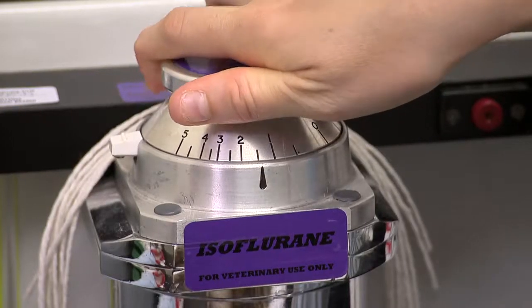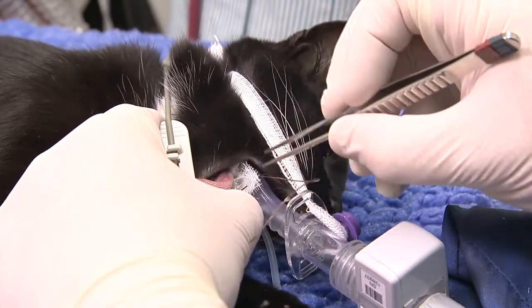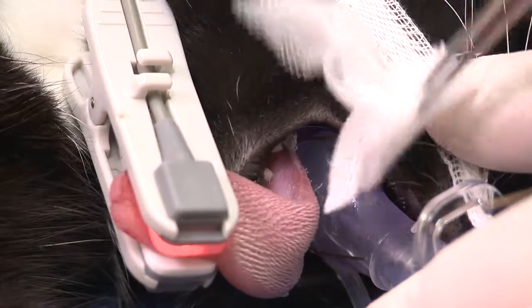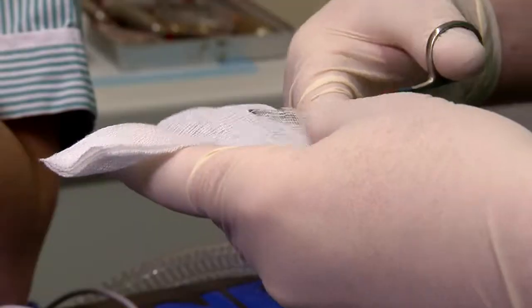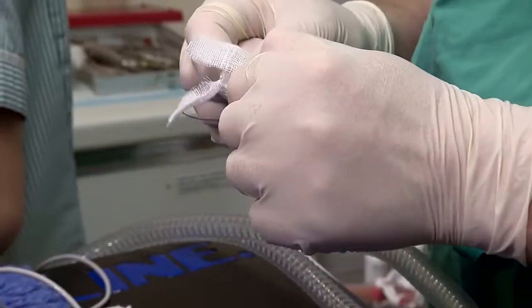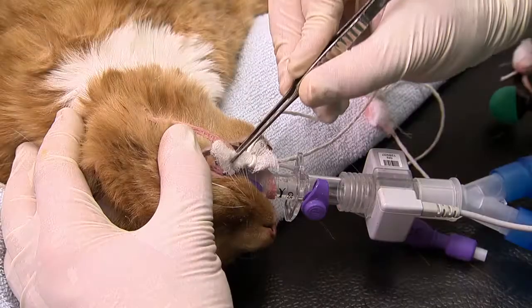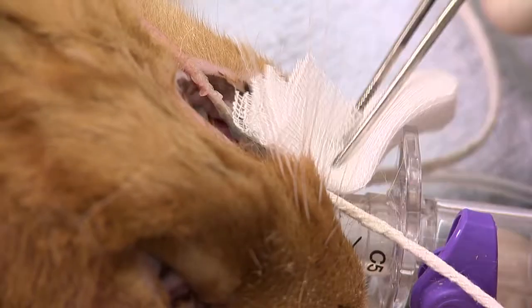When using V-gels for dentistry, throat packs should be inserted to soak up any excess fluid and protect the airway. These are made from surgical gauze with a length of tie attached for easy removal after use. Place them above and below the V-gel and change for new ones when they get soaked.